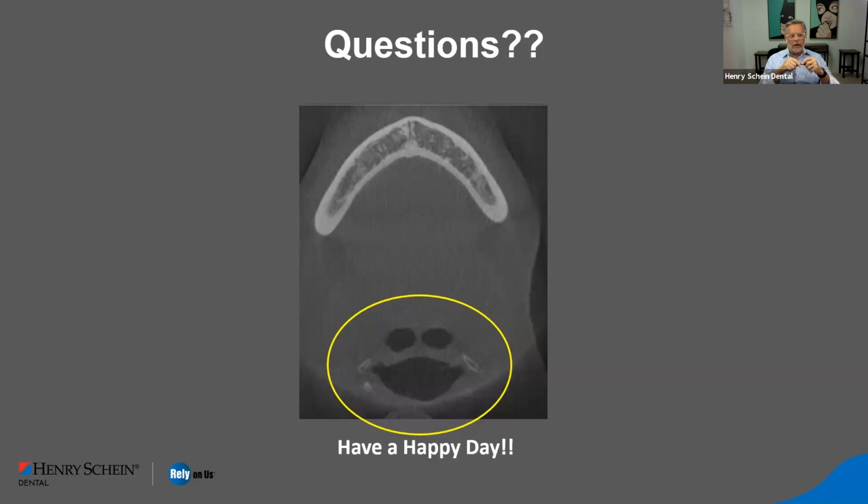Great. One last question, but maybe we've got it answered. Let me just check if I understand it. Do you always take a CBCT after grafting? No, you're recommending 2D immediately after grafting, unless there was any complication in the case. So that answers that question.